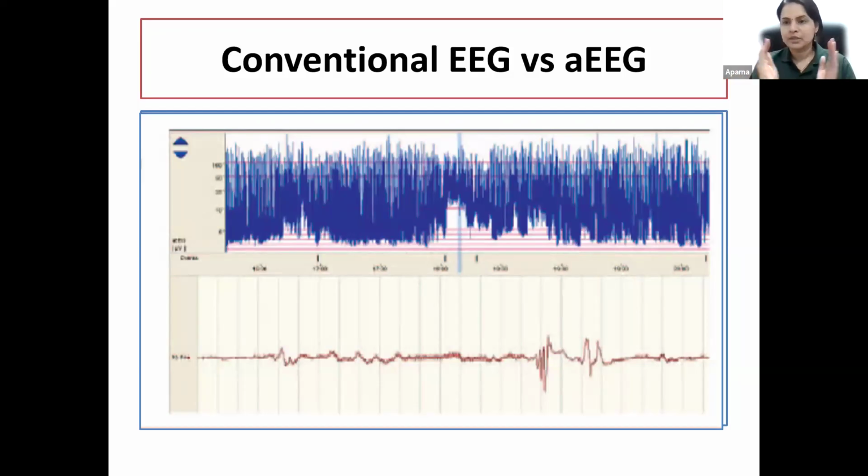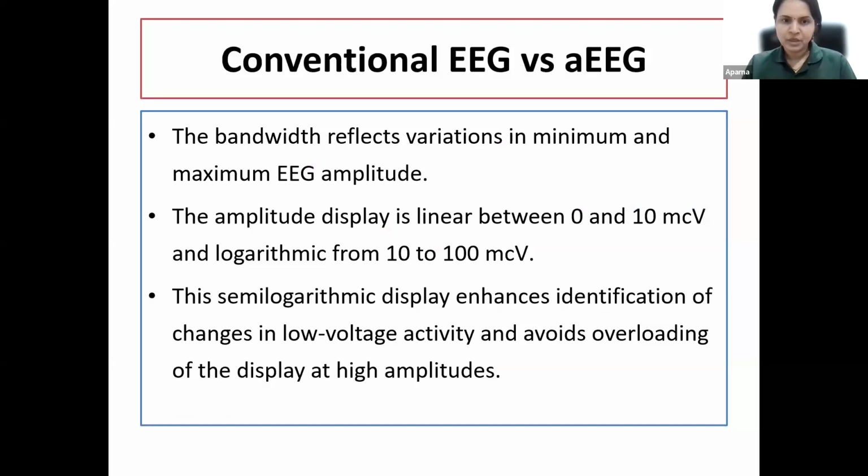It is also compressed in time, and it amplifies the electrical potentials derived from these biparietal leads. So in other words, this is an amplified, rectified, semi-logarithmic scale, compressed form of EEG, which generally runs at the speed of 1 hour within 6 centimeters. So you might be able to see many hours of EEG tracing within a short waveform like this.